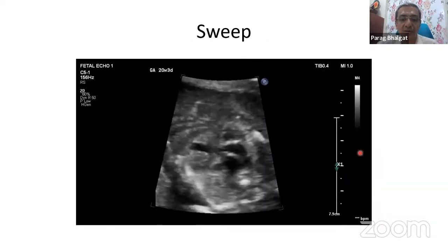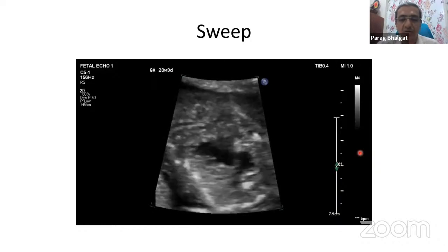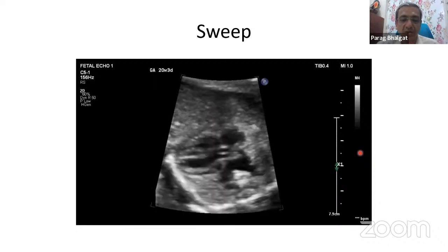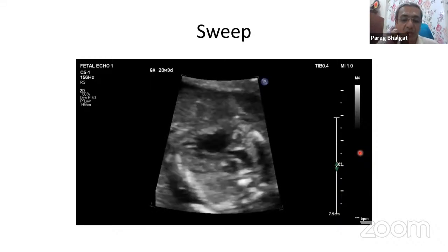A sweep, just to go through it again and again. I'll run it 3-4 times so you understand this. Cardiac apex and fundic bubble, AV concordance, VA concordance, perimembranous VSD, all things are quite well seen.